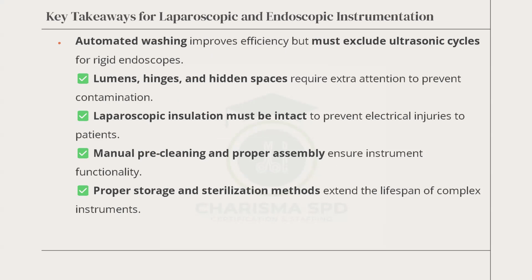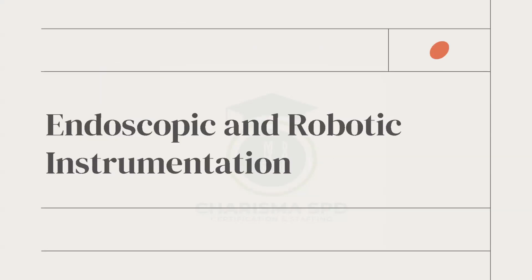Manual pre-cleaning and proper assembly ensure instrument functionality. Then, proper storage and sterilization methods extend the lifespan of the complex instruments that we have been talking about. Next slide.